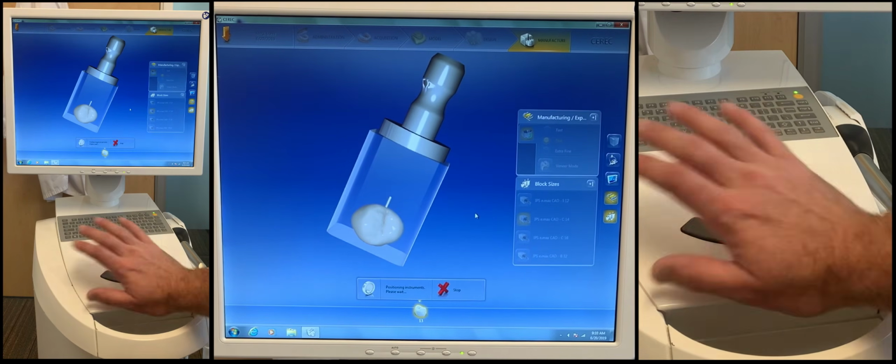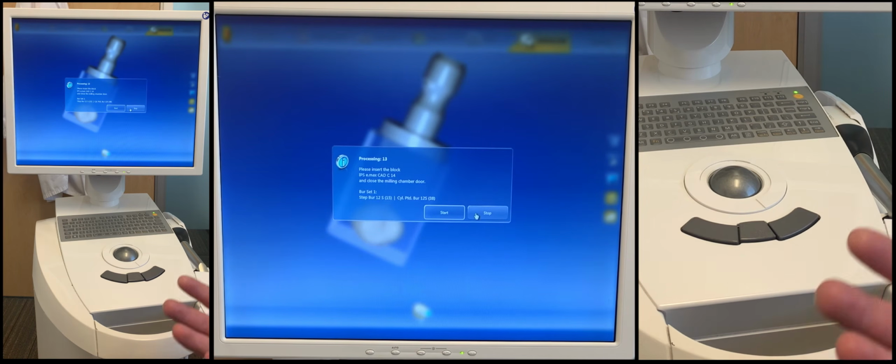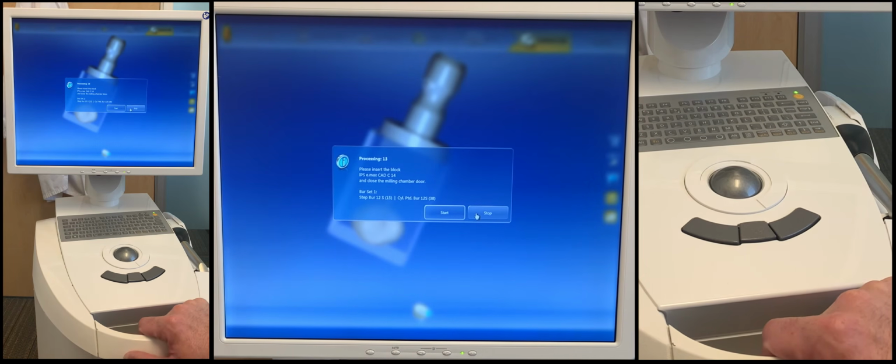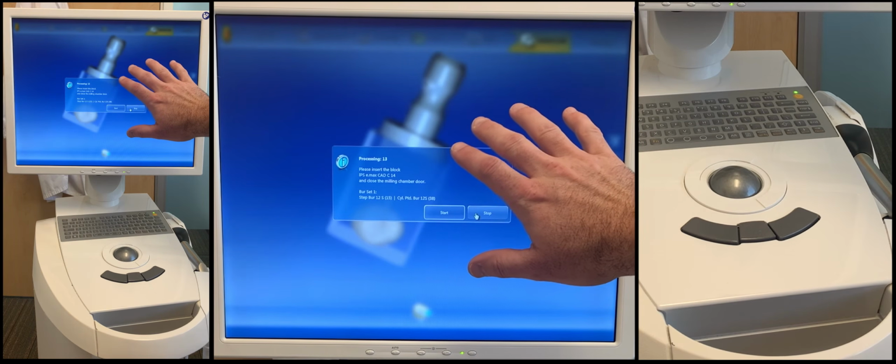So a couple of closing remarks here as we conclude this video. Honestly, the most important thing is that you spend some time practicing. Get comfortable with it, get familiar with it. You want to make sure that you know what you're doing before you walk into a patient room and try to design 6 crowns with a patient staring at you, no temporaries, having all sorts of stress. I would suggest getting comfortable and getting familiar with how the machine works, how the process works, before you spend any time using it on a patient. But when you're ready, this software version, 4.5.2, will do most of the work for you.